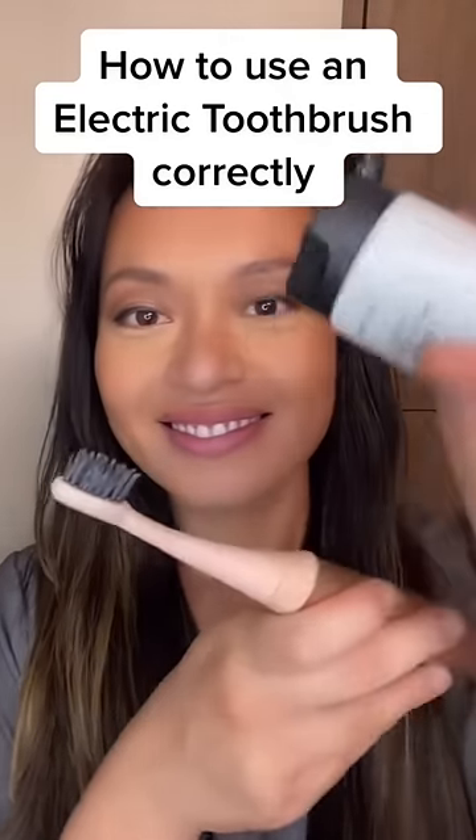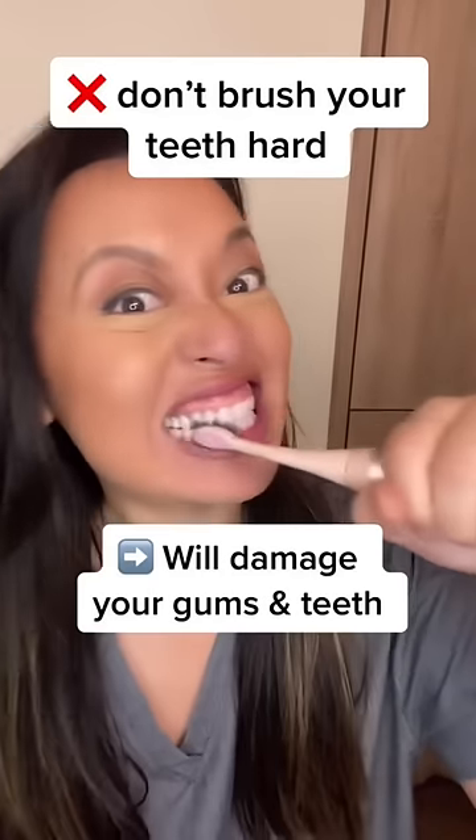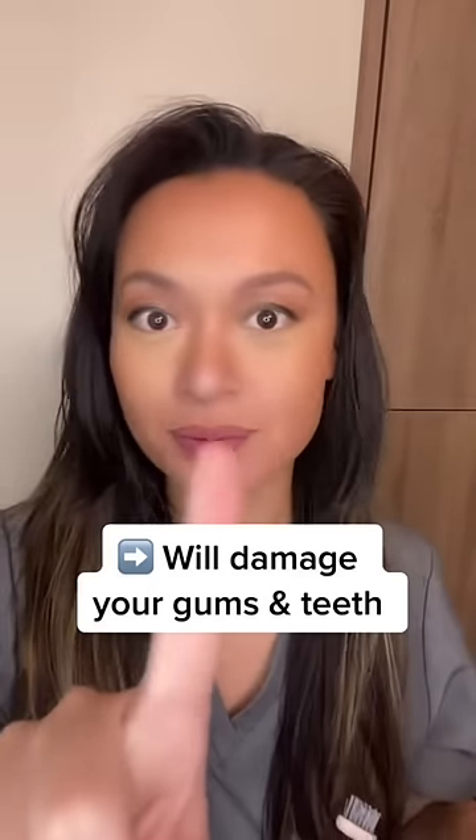How to use your electric toothbrush correctly. Use a pea-sized amount of toothpaste like this. Now don't do this — you can do some serious damage to your gums and teeth.